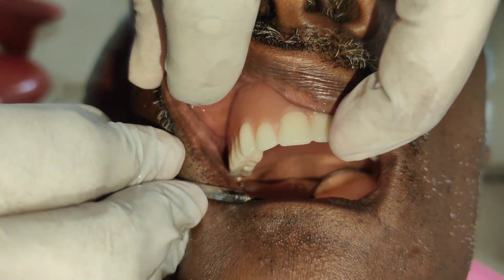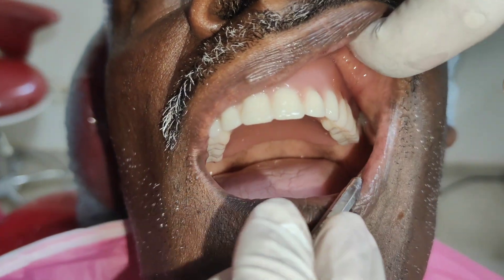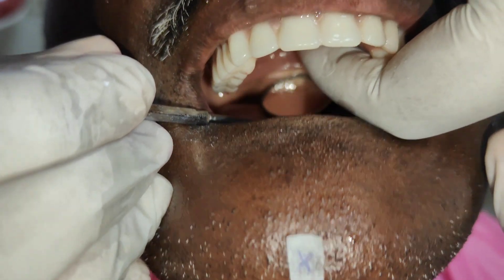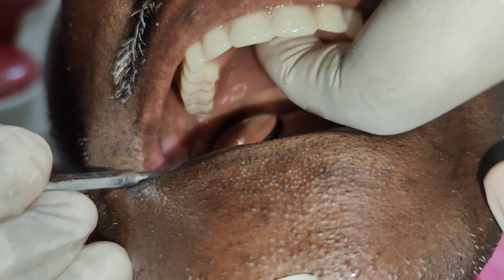There should not be any escapement of air bubbles when the patient says 'HA'. The index finger is placed on the palatal surface of the denture and the patient is instructed to say 'HA'. After checking the peripheral adaptation of the maxillary denture, the mandibular denture is checked for peripheral adaptation.